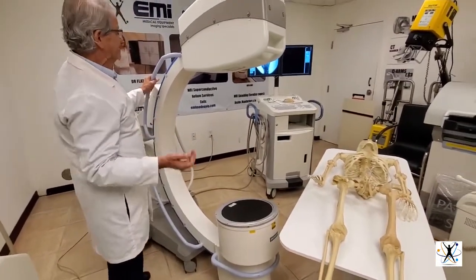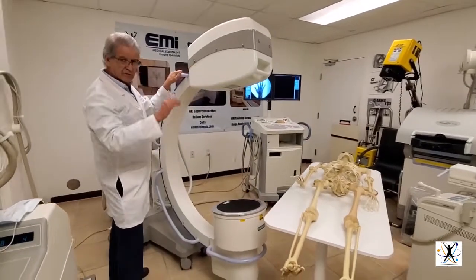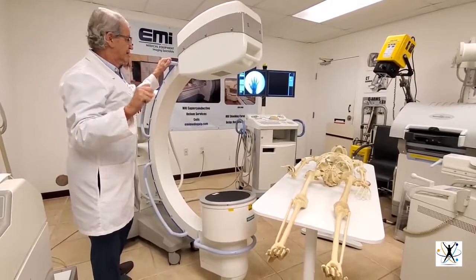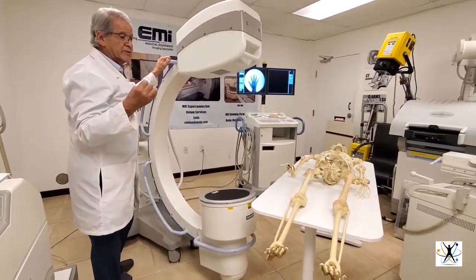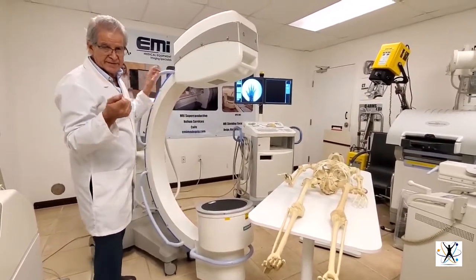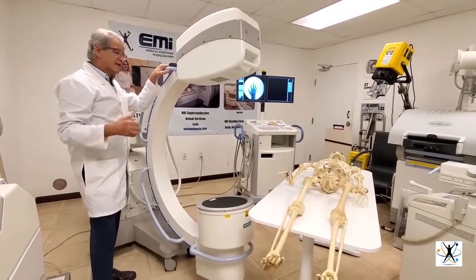Then we will see the images in the two monitors, and there we also have controls where you can call the patient, put in names, organize many patients, store and send images, make CDs, DVDs, or transmit to PACS and other servers.